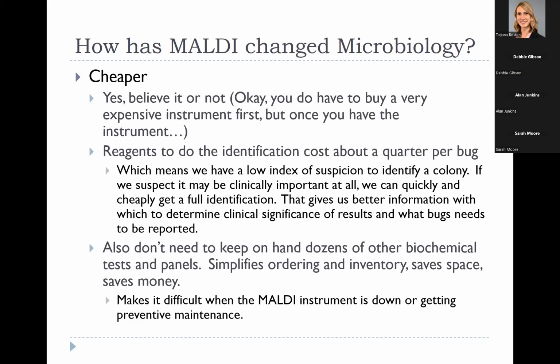Okay, so I don't know. When we isolate a Wautersiella kentuckiensis, I don't know. I've got one report in the literature that says it was isolated from a case of pneumonia. I'm making that up, but I don't know how many times it was isolated from patient specimens that was completely meaningless. So how do you handle these?